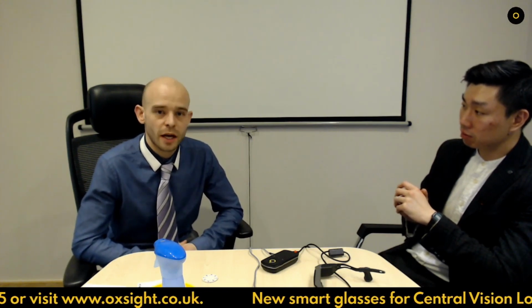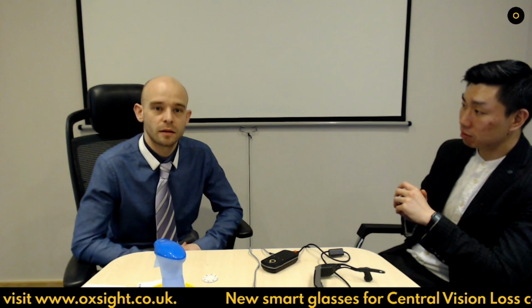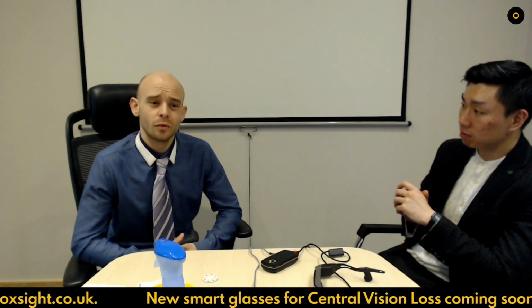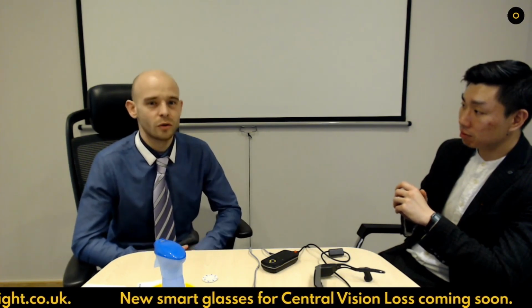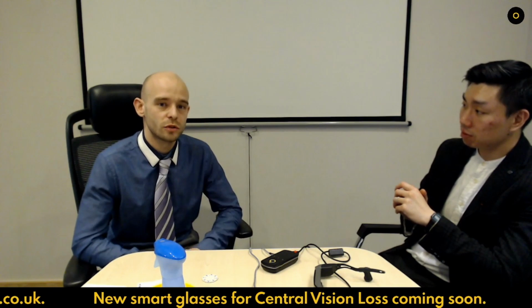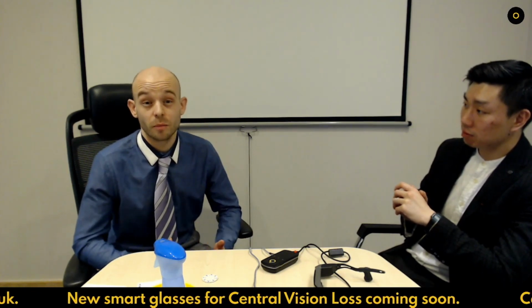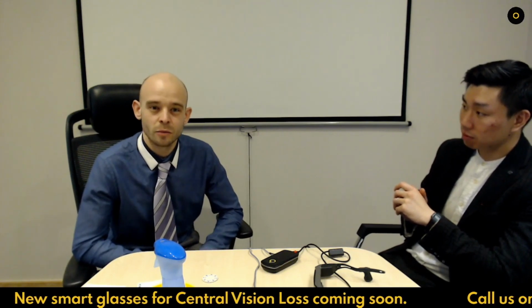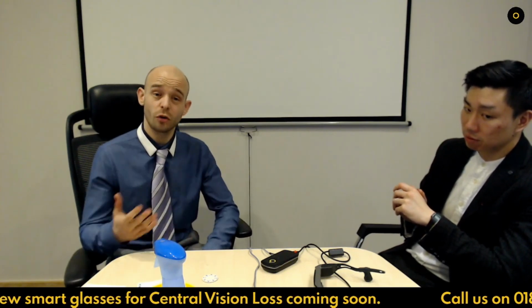I heard about your glasses, they sound amazing, I think they could change my life. And then unfortunately you have to give them the bad news of saying actually this particular pair of glasses, your clarity is quite low, your field of view may be too reduced, you may be only having light perception, which means that you can only see sort of lights going on and off. Glasses aren't really going to benefit you, unfortunately.